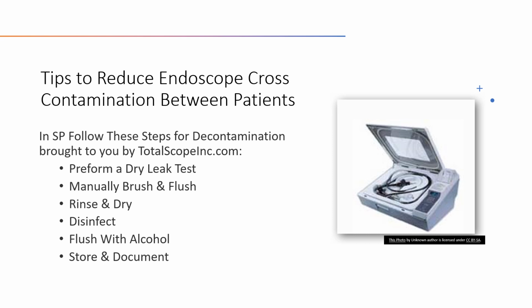Once you have an endoscope that passes the dry leak test, your next steps are going to be manually brush and flush the lumens. And it's important to make sure right here that we are choosing the correct brush size according to the manufacturer's IFUs. I hope that you know what IFUs are, but if you don't, those are instructions for use written by the manufacturer of that device.